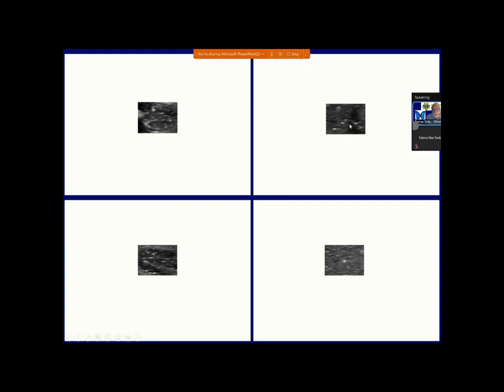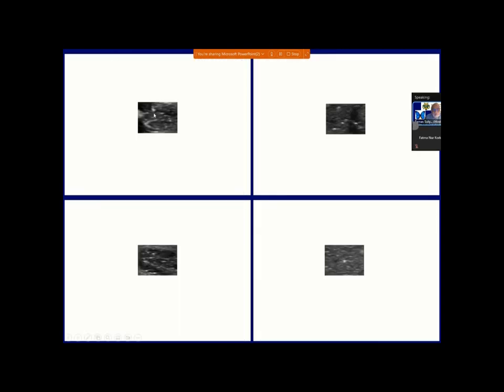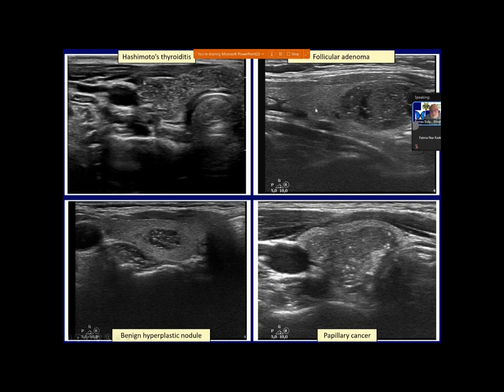The real issue is the left upper case. This has echogenic lines, but echogenic granules clearly prevail. So, sorry, I made a mistake. So these were in that magnification. Synchronous presence of lines and granules in these two cases, but in the right two cases, we had no clue even at a larger field of vision. If we take the entire nodule into account, then this is a quite reassuring pattern. These are back wall figures. Here arises some doubts, but I leave this case for the final discussion.